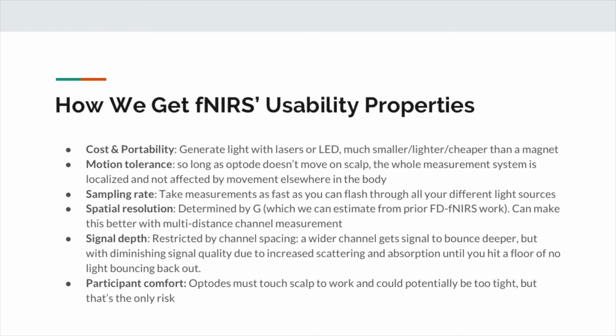That being said, you can do fancy things like, I'm just going to assume that light from over here can't reach over here, so I could maybe fire these both at once. Or if you're doing a dyadic study where you've split your channels between two people, those can be firing at the same time.